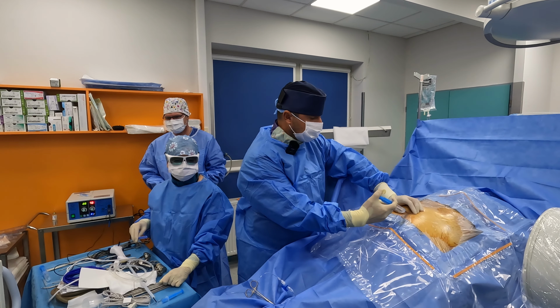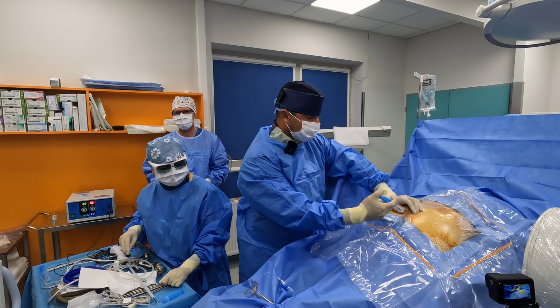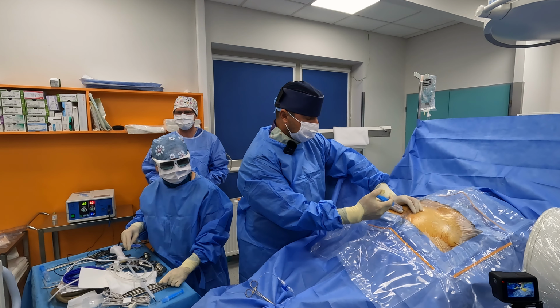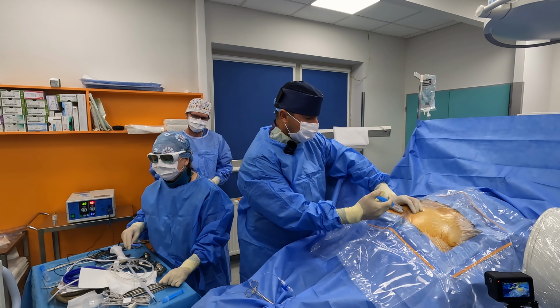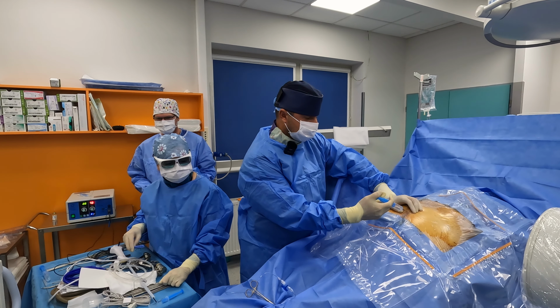So you're infiltrating the local anesthetic, and with a local anesthetic needle, you are also checking the angle and the trajectory of your epiduroscope for the next step.